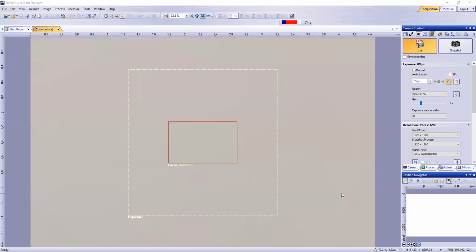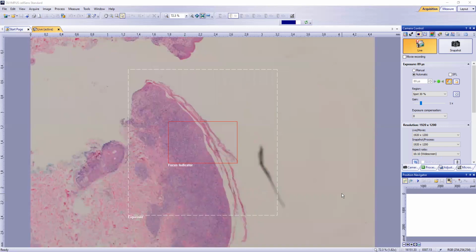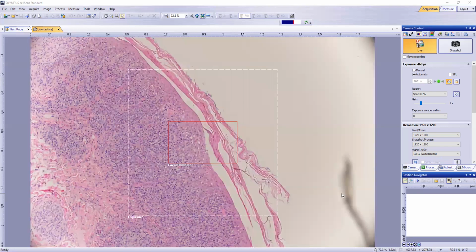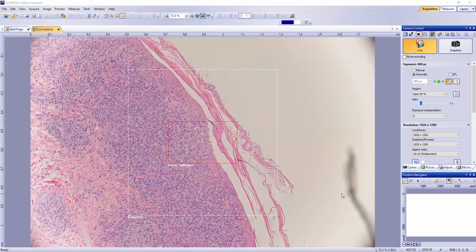So now let's contrast that with syphilis. In syphilis, parakeratosis is the norm. You will see some degree of parakeratosis in syphilis. And here you can see in syphilis, we've got a little bit of parakeratosis in the stratum corneum.